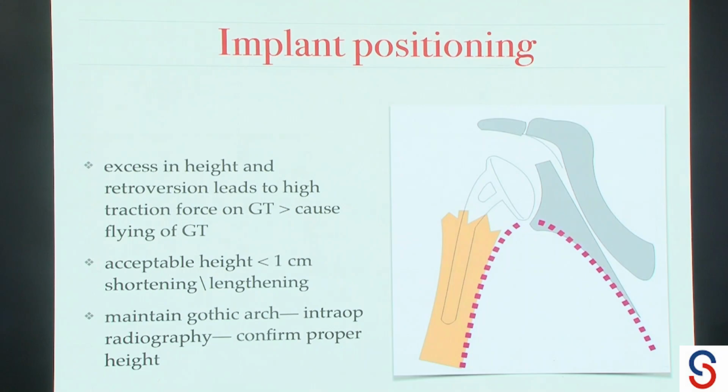I agree, he is helping me, but he has no surgical inclination at all. They do their own thing. We have to be in control. There are 2 different techniques and both techniques give different versions for the same patient. Okay. So they will give you the epicondylar axis. Okay, and that's the more defined technique in literature and that's how they are taught to do it.